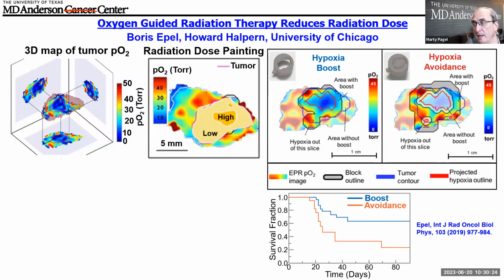And then they would irradiate. So they're irradiating only the normoxic sections, not so much the hypoxic section. And of course, tumor mouse survival went down quite a lot. So again, this idea of getting a reliable PO2 map, especially in real time, that could then be applied to the patient with radiotherapy right away, right there in the clinic, I think would be a home run, because then we could finally get to really outstanding dose painting based on PO2.